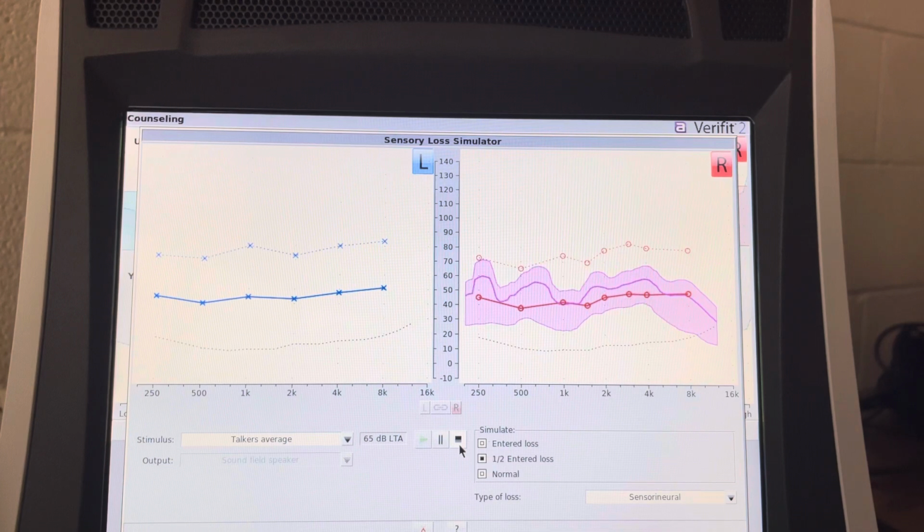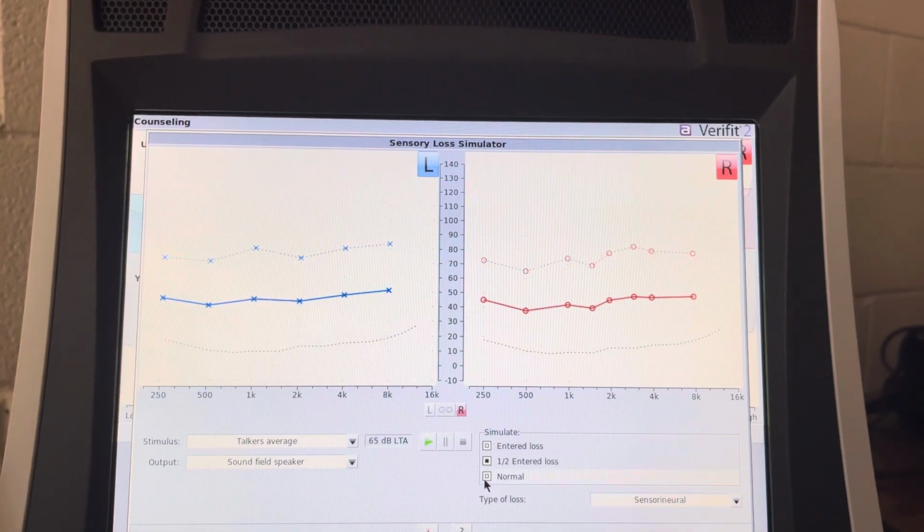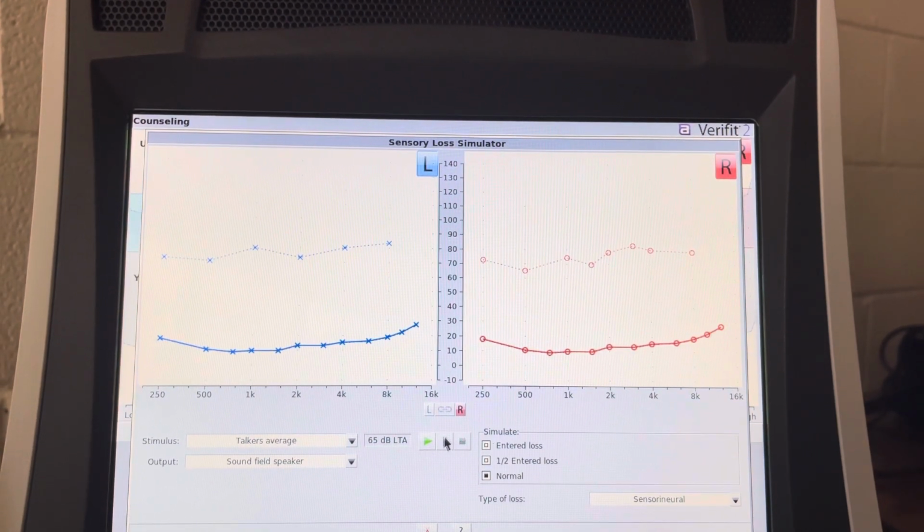Tell me about it. Okay, so that is much better than the first one we listened to, but it still is soft, and let's compare that to normal now.